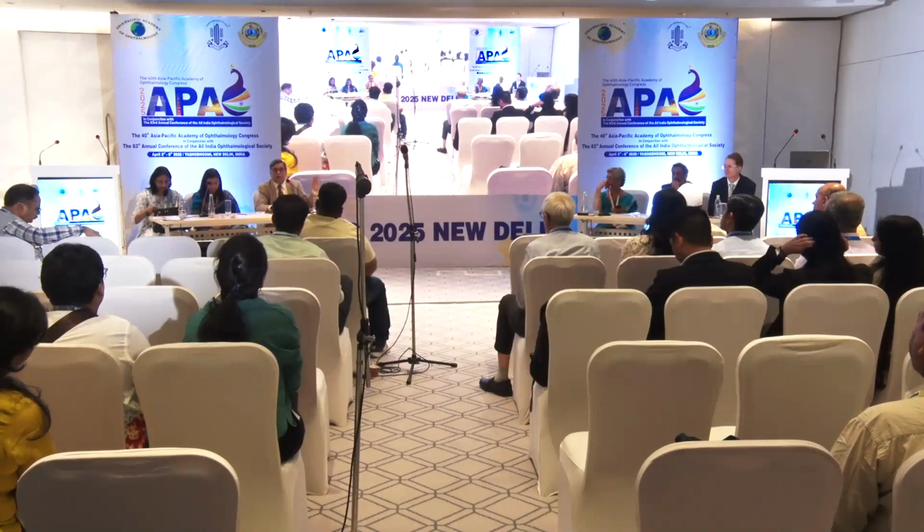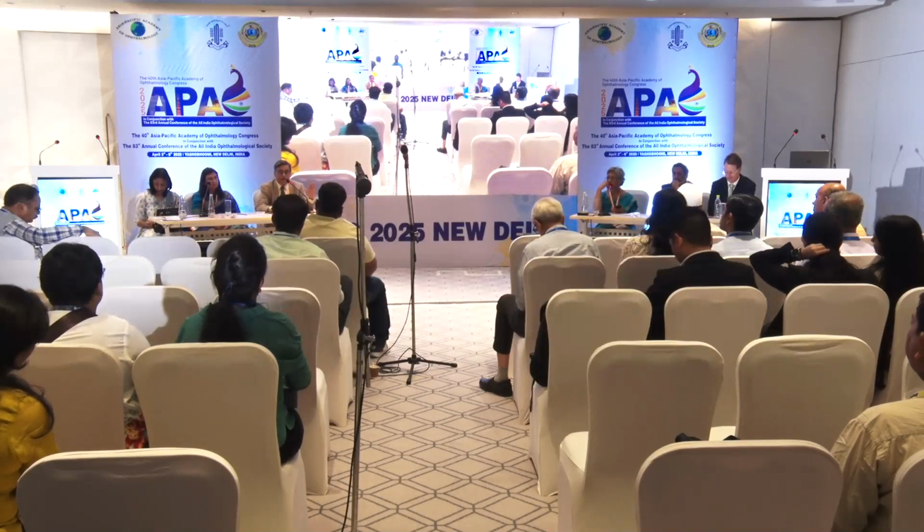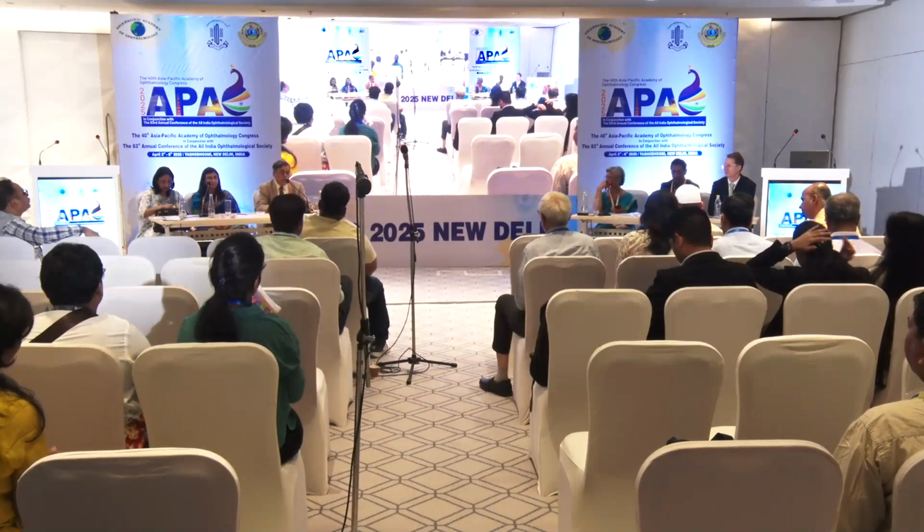Treat the patient, use the OCT judiciously, and you will be able to deliver better services to your patients than ever before. Thank you very much, ladies and gentlemen, for being here today.